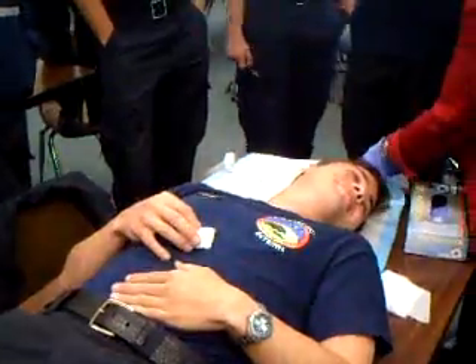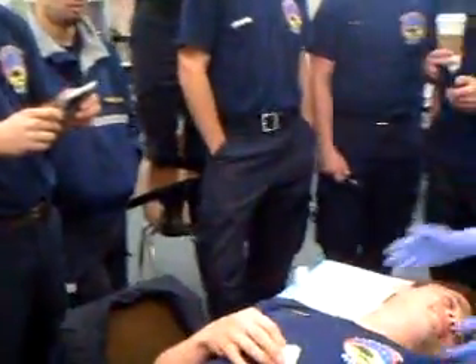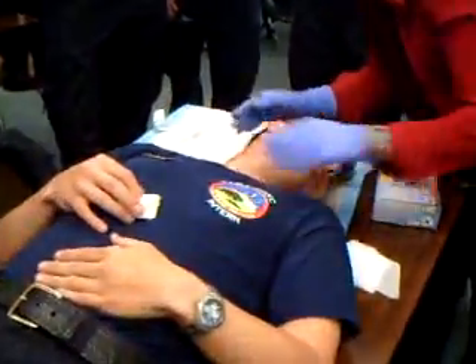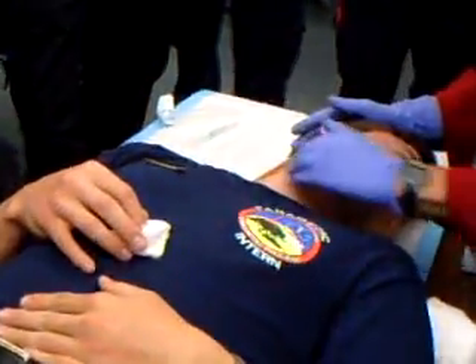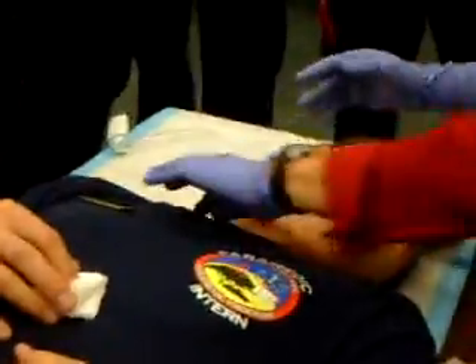No blowing. Can I put it here? Felix's neck — can't work out. It's like if I'm over here, I'm not lined up with the vein. But if I put myself right here — see, I notice how I turn it more, and then his sternocleidomastoid actually sticks out a little bit. So I kind of want it right there for him.